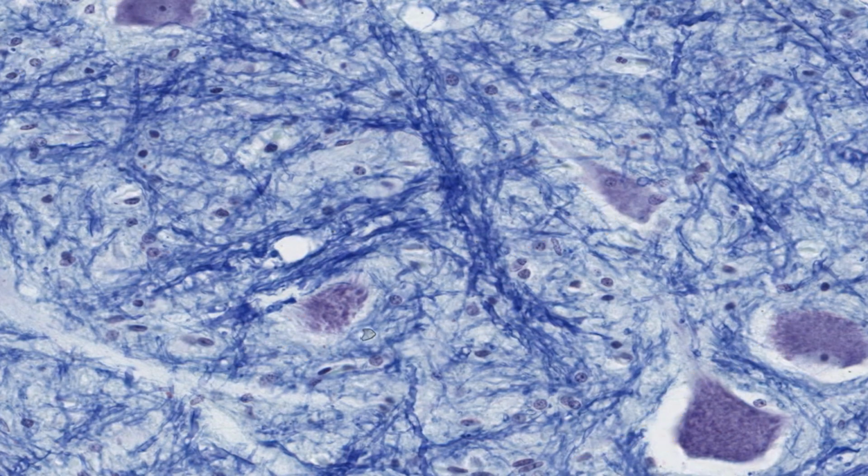It shouldn't be difficult to convince yourself that two main categories of cells are present. These larger, paler nuclei with somewhat irregular shapes belong to astrocytes. They are the most numerous of the glial cells and also have the most diverse functions.